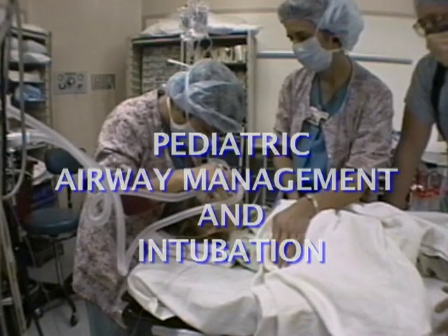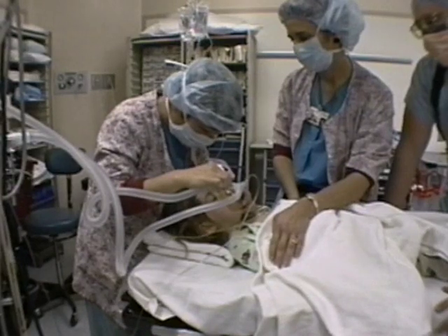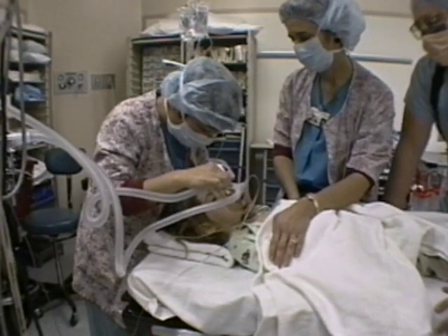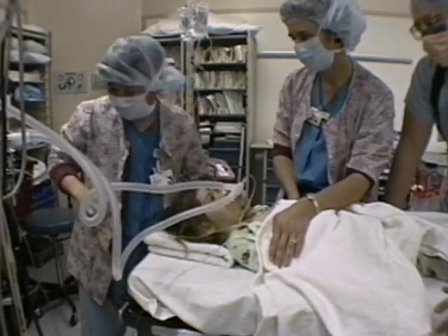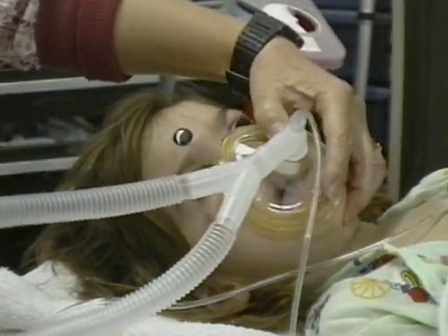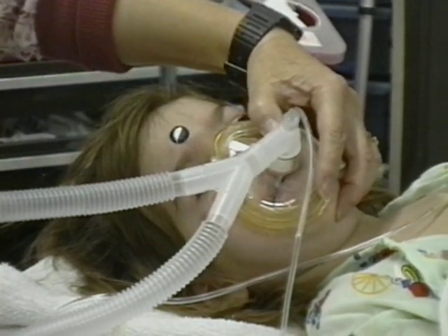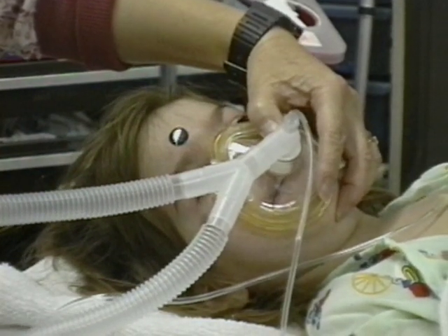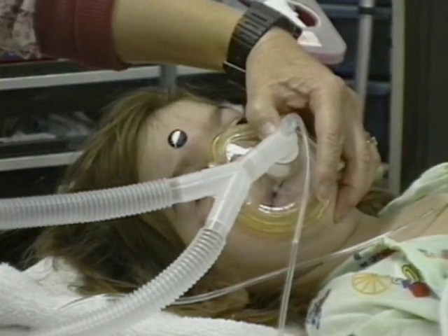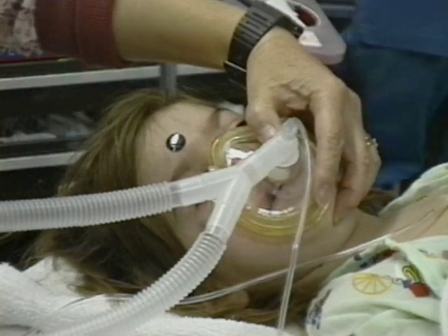Children are not miniature adults. From infants to teenagers, the anatomy and physiology of the child is in a continuous process of morphing into the adult form. These differences make managing the airway and intubation more challenging than in the adult. This video will build on your basic skill set for adult airway management and intubation to detail how to adapt your techniques to the pediatric patient.